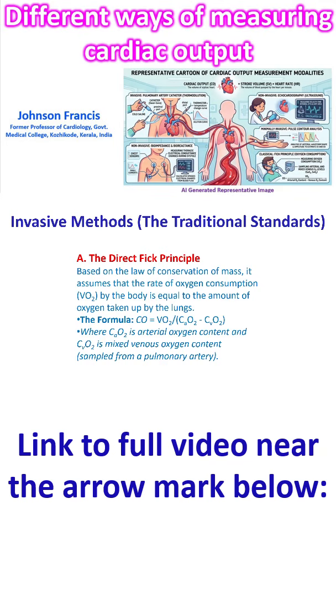While considered a gold standard, true direct Fick requires a metabolic hood to measure actual VO2. In most cath labs, indirect Fick is used, substituting assumed metabolic rates based on age and sex, which introduces error in hypermetabolic or critically ill patients.